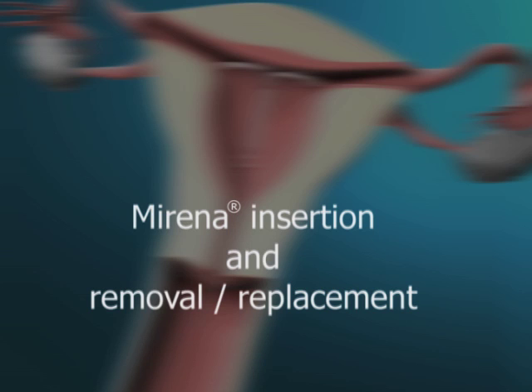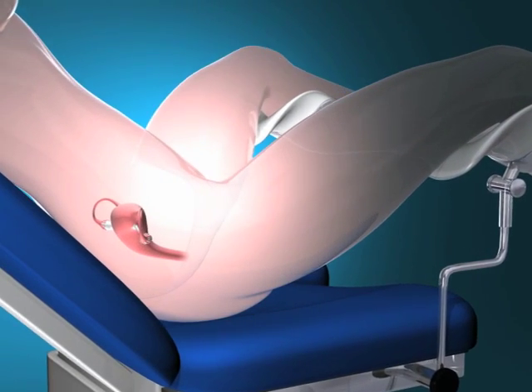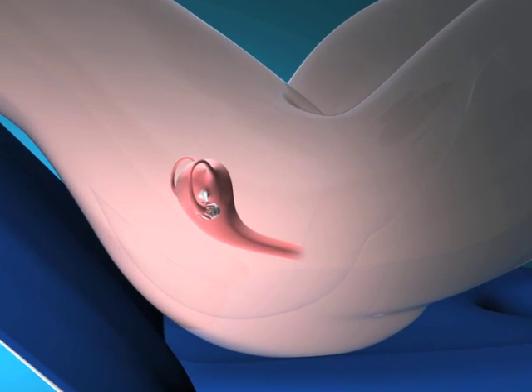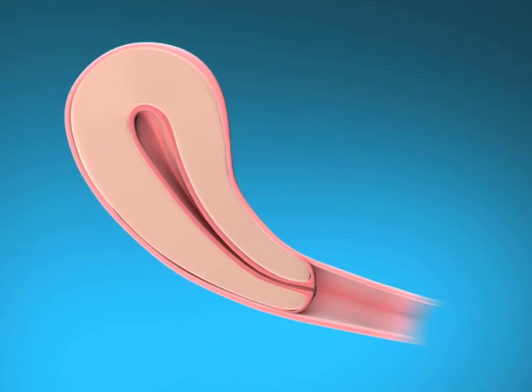Mirena insertion and removal replacement. Preparation for insertion: examine the patient to establish the size and position of the uterus, and in order to detect any signs of acute genital infections or other contraindications for the insertion of Mirena, and to exclude pregnancy.